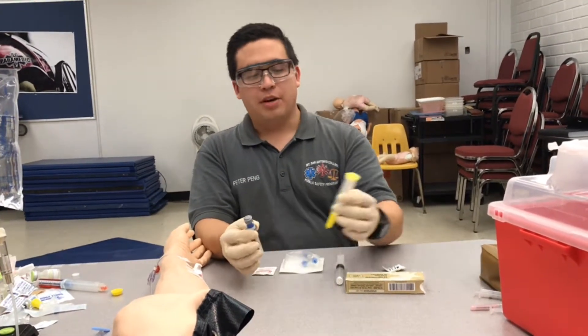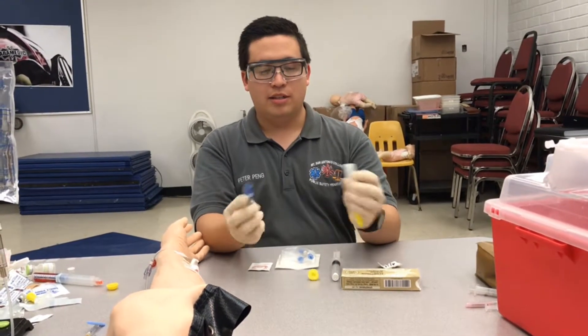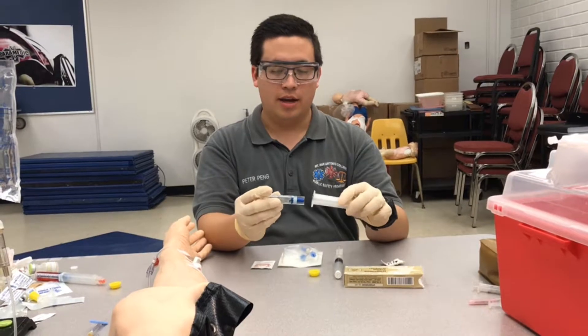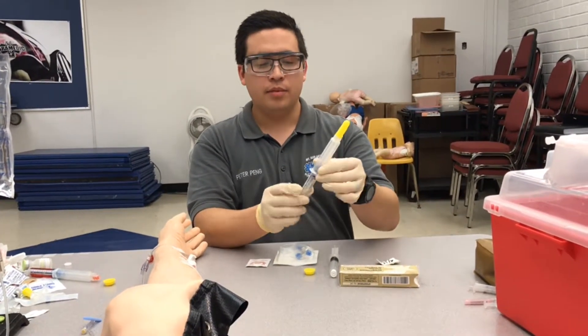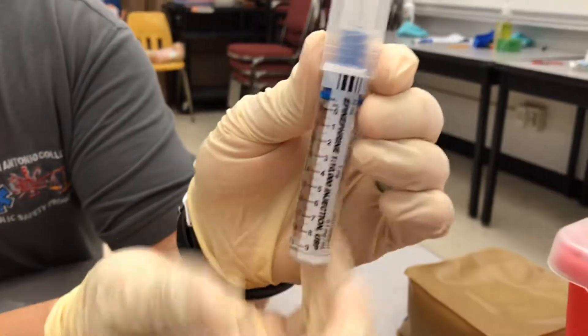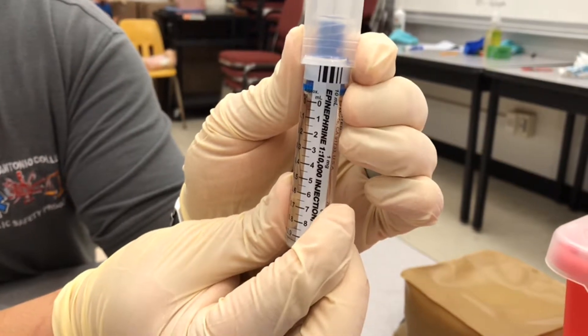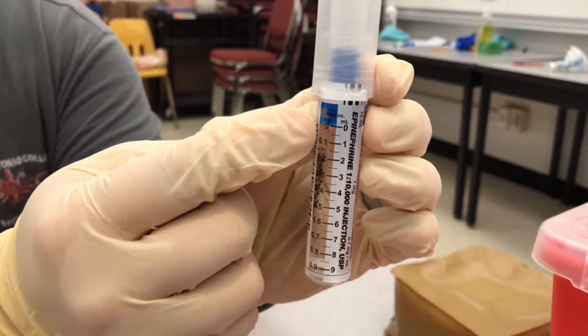Now I'm going to put together my epinephrine. First take off both of the caps. Make sure you maintain aseptic technique and we're going to screw these two together, and then we're going to zero it out. Hold it upright and start pushing on the glass until you get down to the zero line.